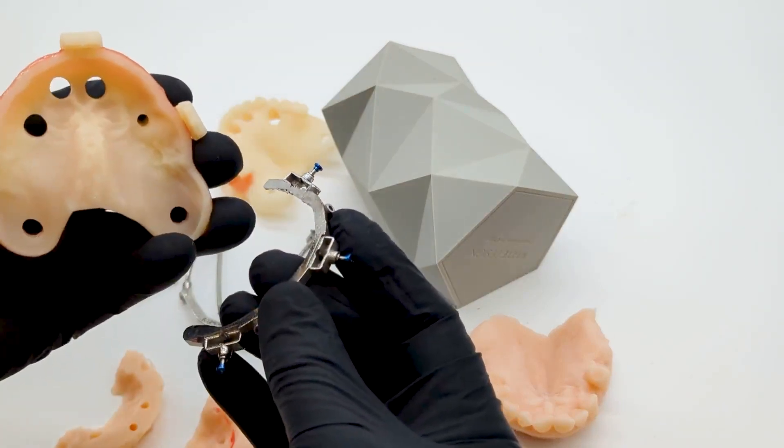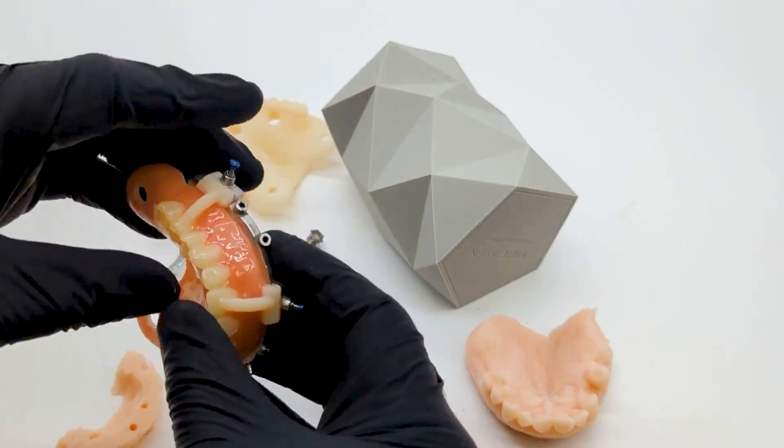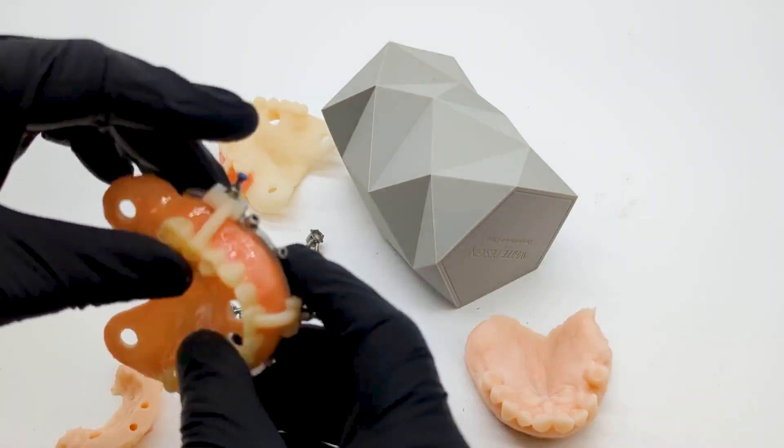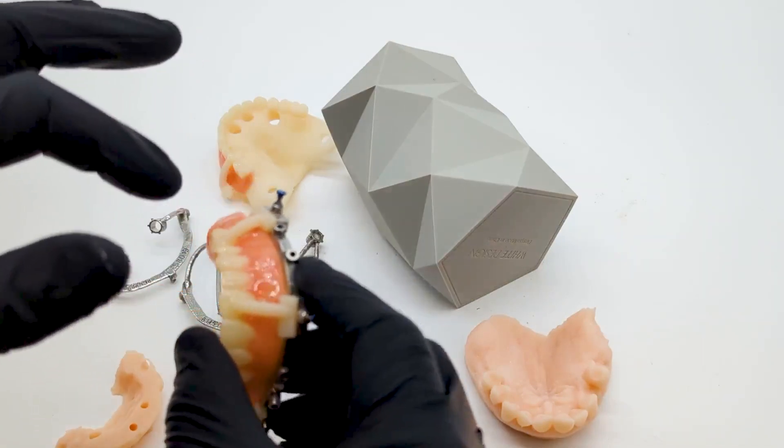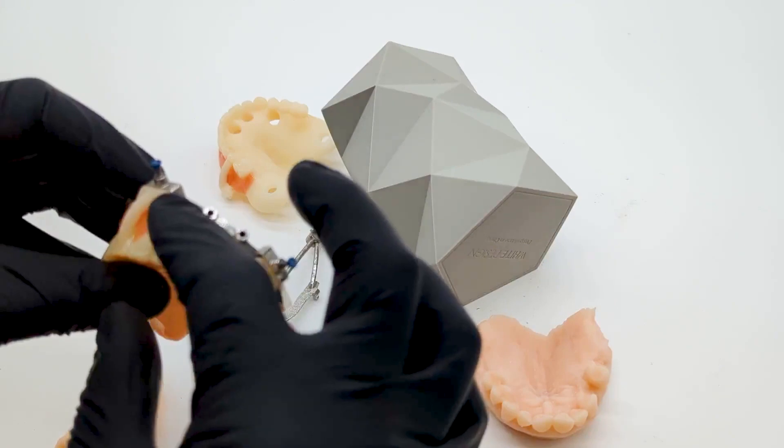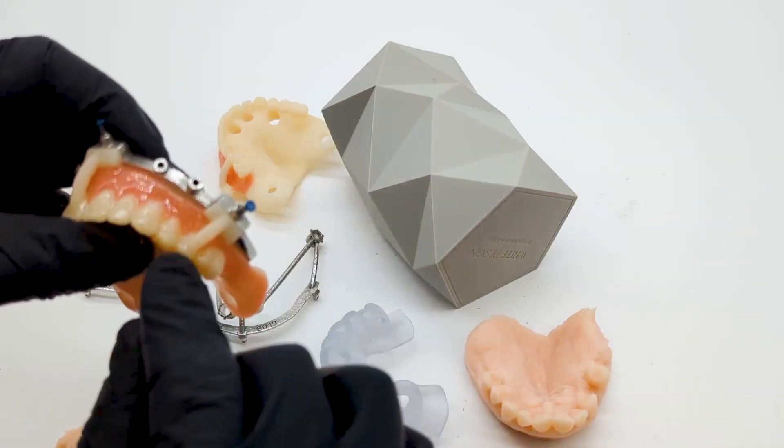It's seated on the fixation base with some special arms here, kind of like an FP1. So we didn't have to have the doctor do any work in the pink area. We attach these arms that go right to the teeth because this is pretty easy to polish as opposed to polishing the pink area.